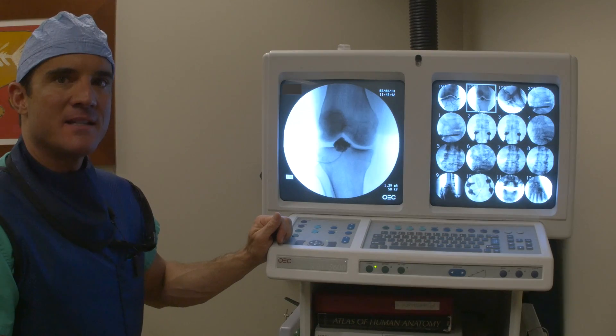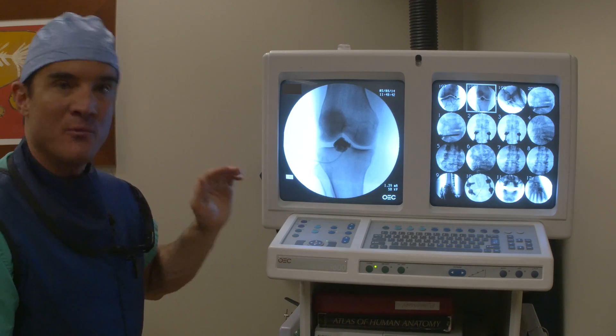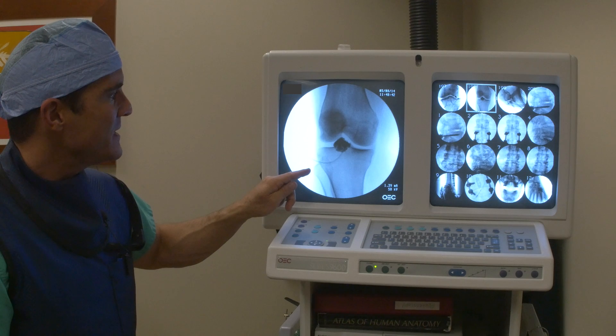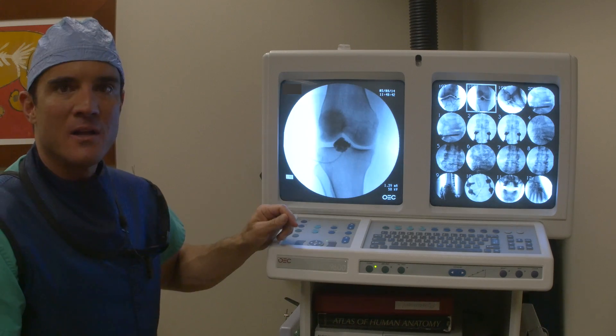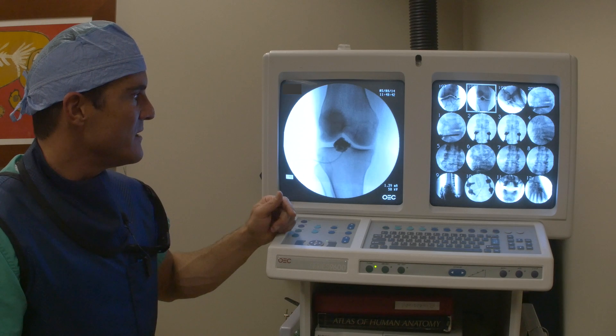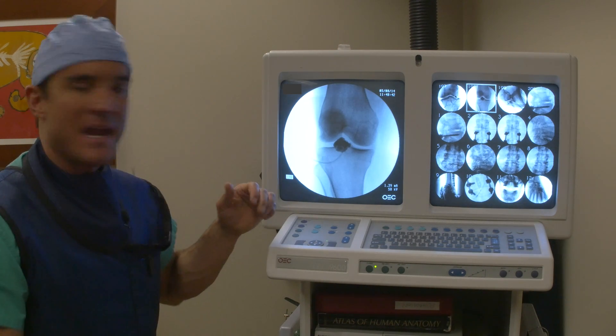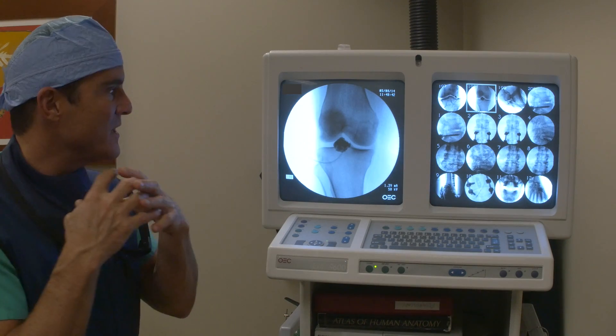As a final example, this is another knee. The needle is in exactly the same spot, it would appear, but when we inject, it looks like a black cotton ball. That means we're in a fat pad. So if we were to inject stem cells into the fat pad, what would end up happening is they would all just collect inside it, and we wouldn't get them into contact with the joint surfaces.